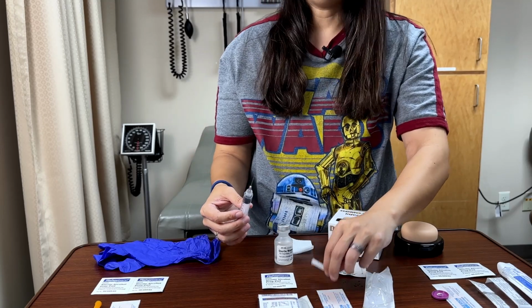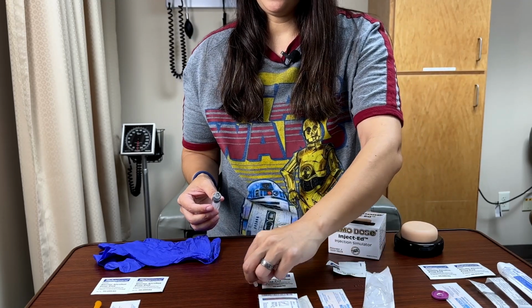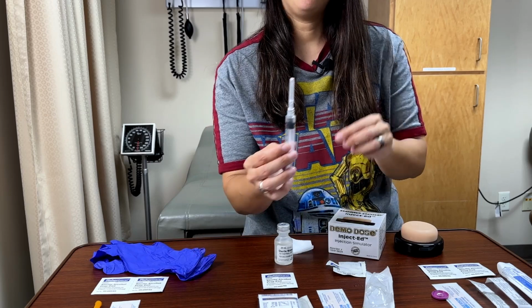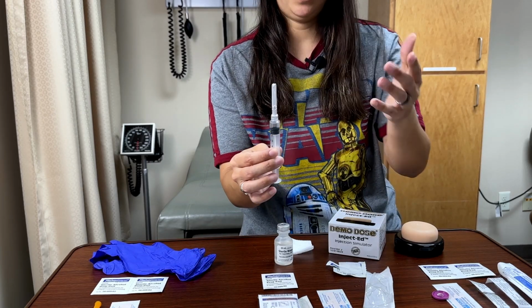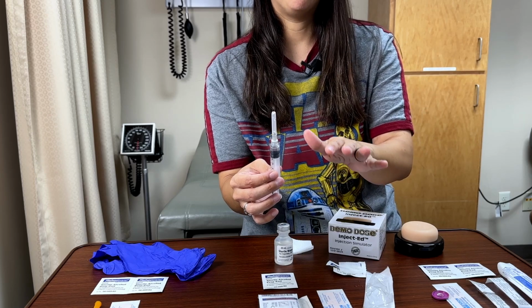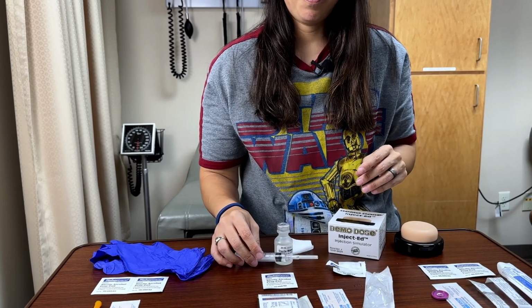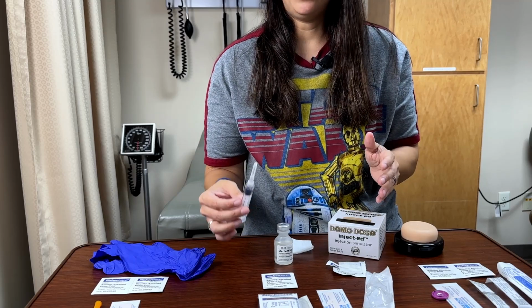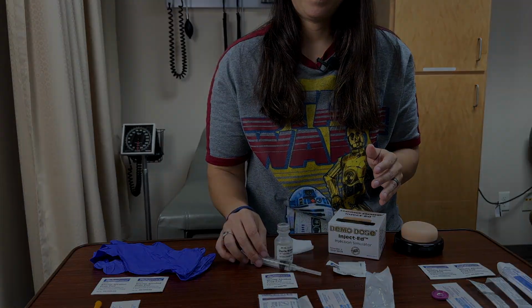From there, always be careful when you're recapping needles. They say you shouldn't, but if you have to, you should fish it up and on the cap and then gently place it down. I have been stuck by a needle before, and it was no fun, so please try your best not to get stuck. All right, now that we have our medication drawn up, we are ready to do our injections.